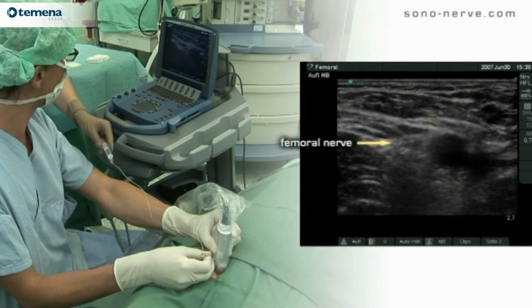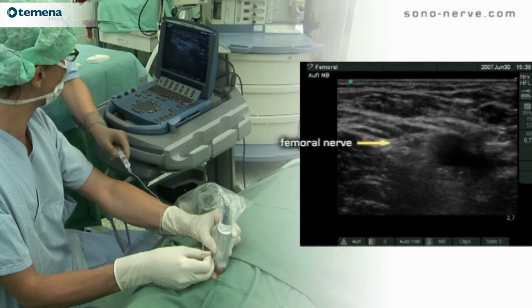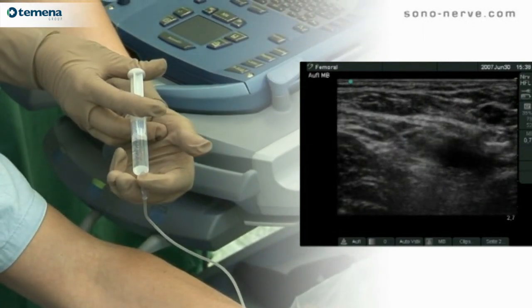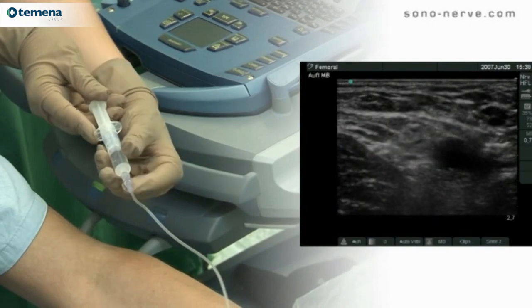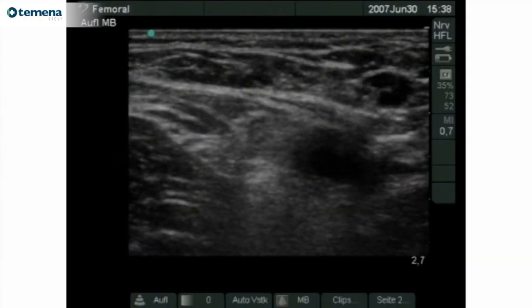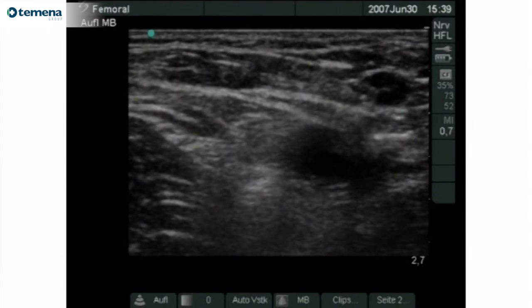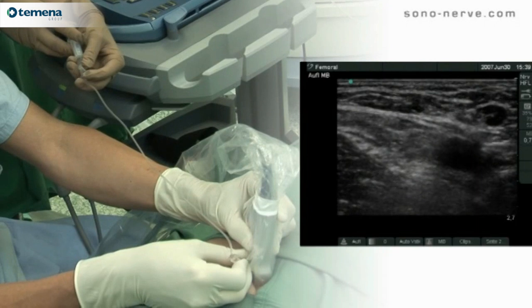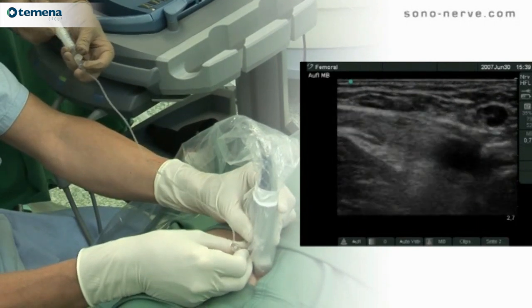The femoral nerve lies lateral to the pulse of the femoral artery, and seen clearly on the ultrasound image is the pulsation of the femoral artery. Medial to the femoral artery is the femoral vein. Overlying these structures is the iliopectineal arch and underneath is the iliopsoas muscle.